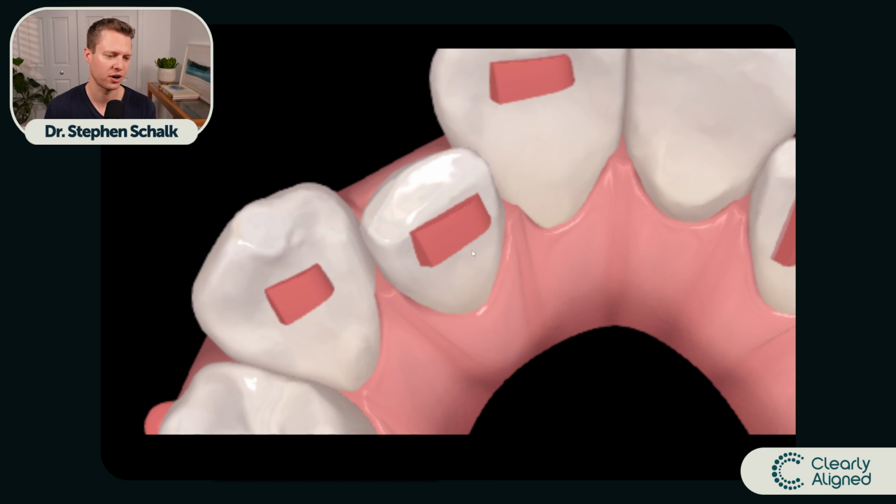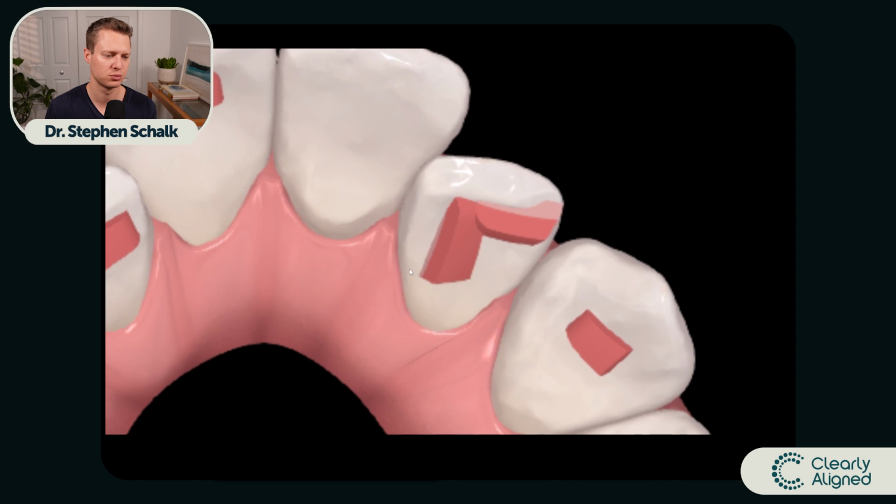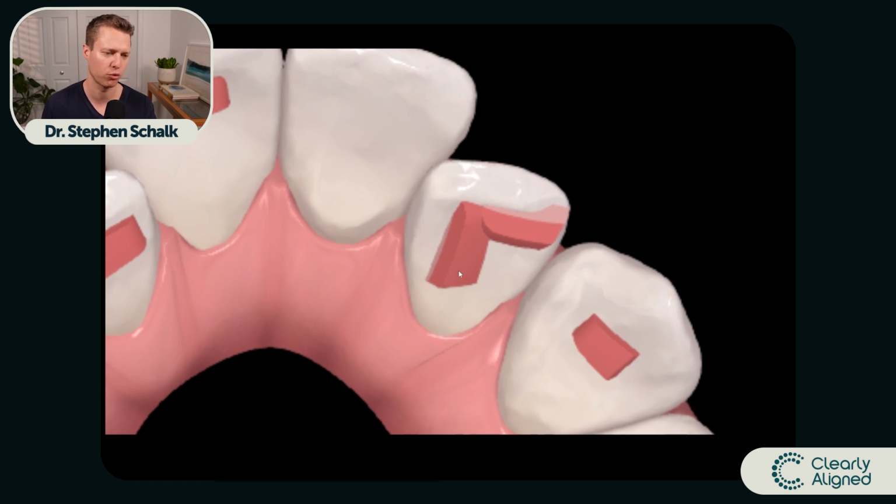Well, you'd take your finger and push right here, underneath this lip of the attachment on the gum side. And that would cause the tooth to move to the buccal. On this lateral incisor, we want to do two things. One is we want to rotate the tooth, but the second is that we want to push it to the buccal, and we want that tooth to extrude a little bit.